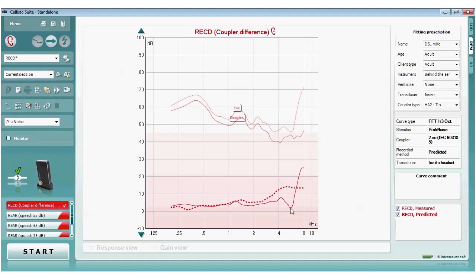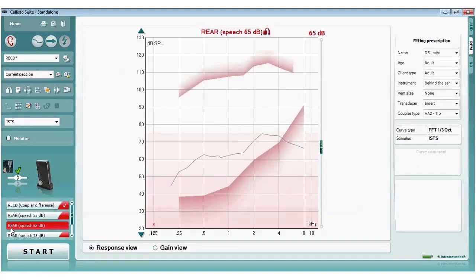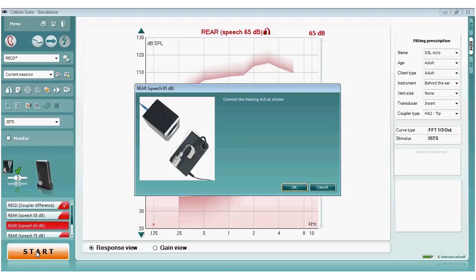Once the RECD is done, the CalREM adapter is swapped for the HA2 adapter, connected to the 2cc coupler, the hearing aid placed on the coupler base, and REAR selected. A picture of the hearing aid attached to a coupler appears in the corner, confirming the RECD has been taken into account and verification will proceed in the coupler. Pressing start provides instructions for positioning the hearing aid and loudspeaker to match target.